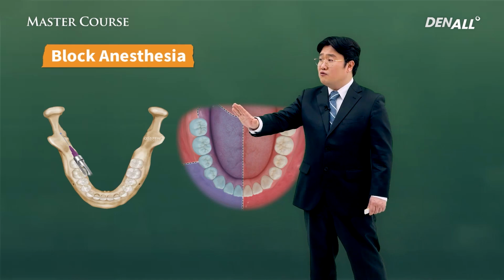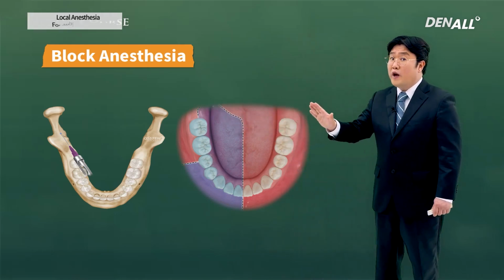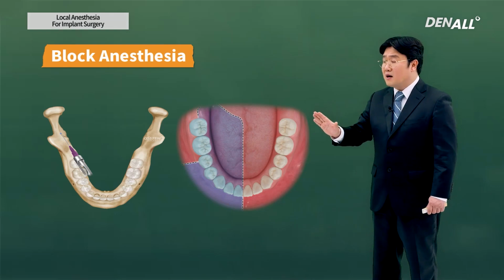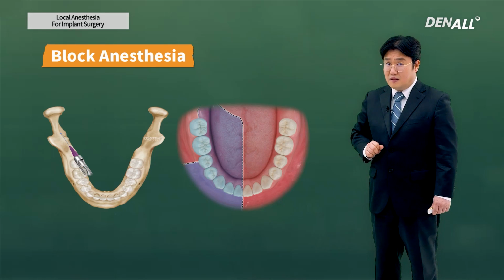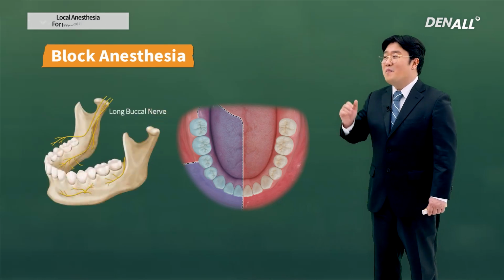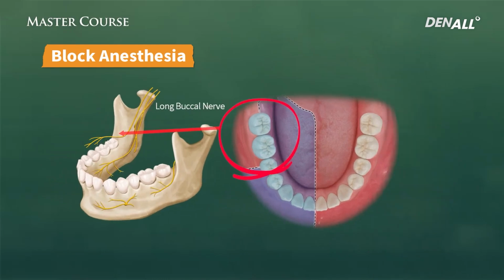And you may ask a question: what about the buccal mucosa of molars? It's not under anesthesia. Why is that? The reason is the long buccal nerve is not blocked. The entry point of the injection needle should be put on the mucobuccal fold of the lowermost posterior tooth and inject 1/3 cartridge into the area.